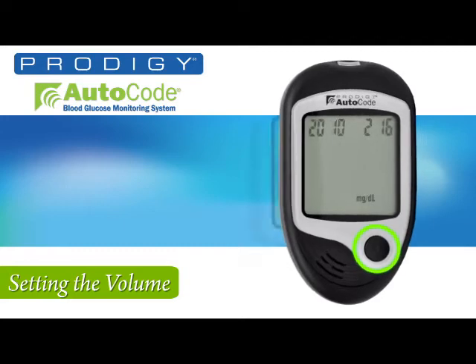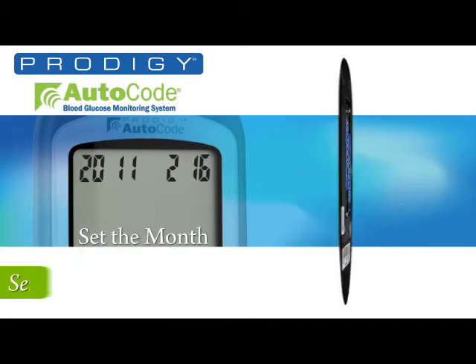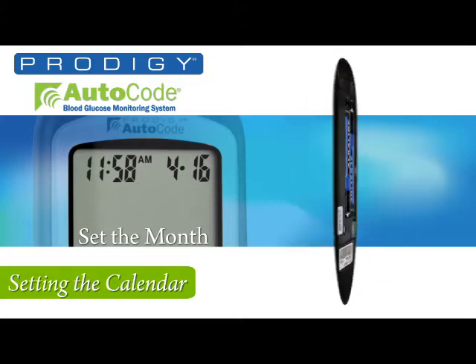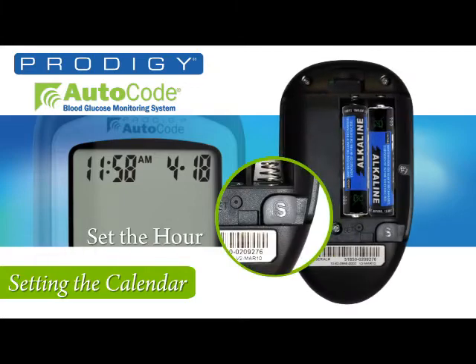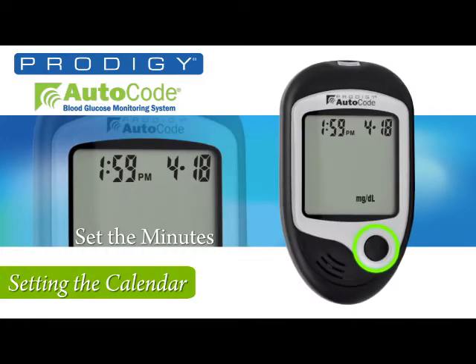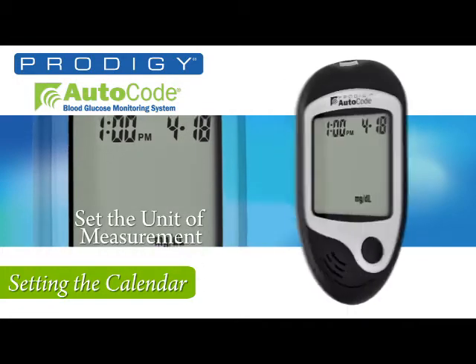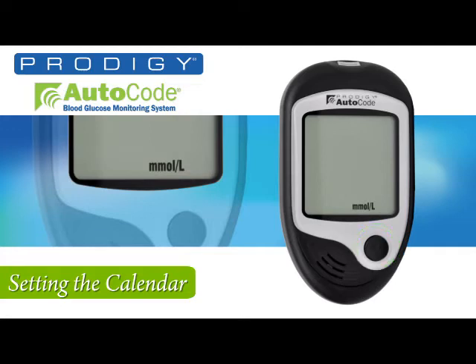Press the set button and then the M button to advance the year. Pressing the set button now allows you to set the desired month using the M button. Set your month and press the set button, returning to the front to set the desired date. Press the set button to set the hour, then press the M button for the desired hour. Press the set button to set the minutes, then press the M button for the desired minutes. Press the set button to set the unit of measurement: milligrams per deciliter for American or millimoles per liter for Canadian.